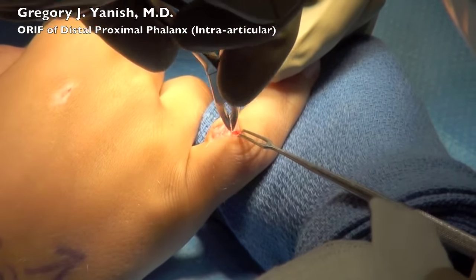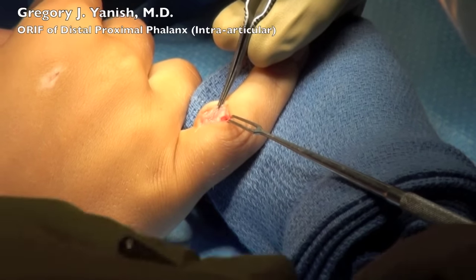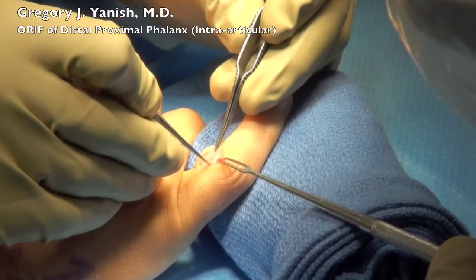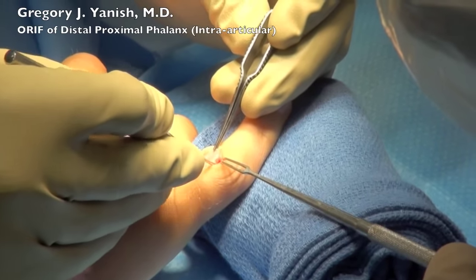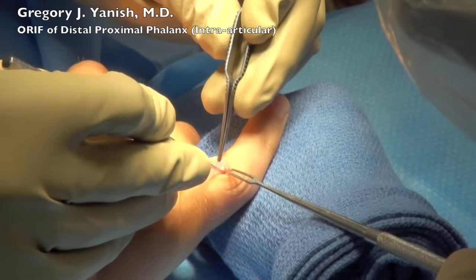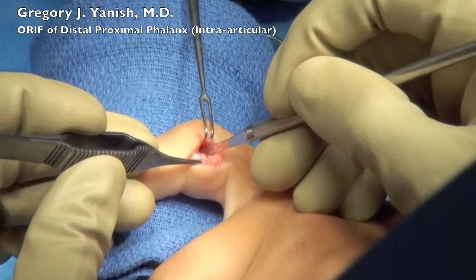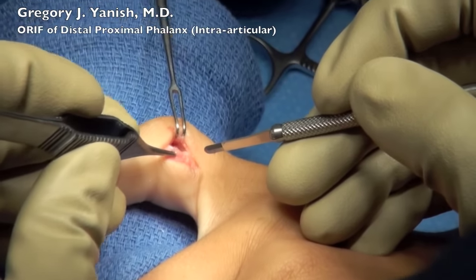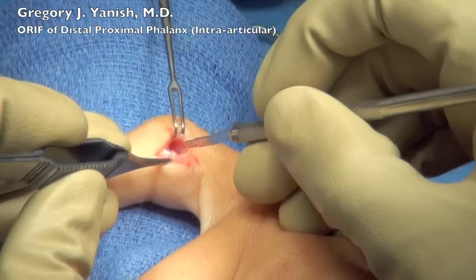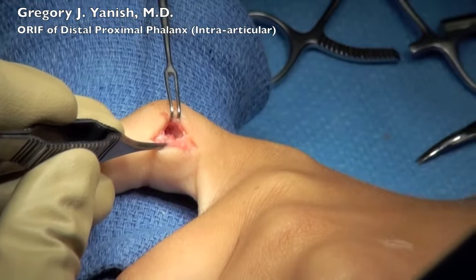There's quite a bit of bone callus, which is where the bone is trying to heal itself, but it's healing itself in an incorrect position. This has to be chipped and gently scraped away with Ronger forceps, and here you can see that I'm using a very small curette. The fracture is in my forceps on the left, and I'm using a beaver blade to scrape away some of the fibrous tissue that's developed in the fracture site.